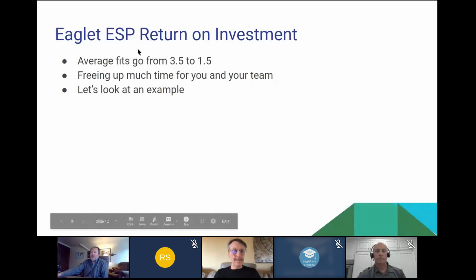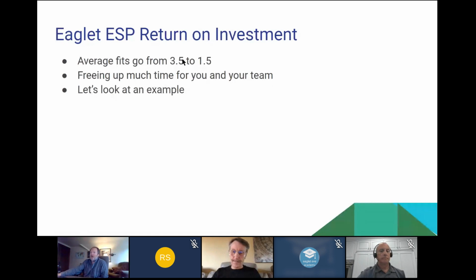So I'm going to talk quickly about the ROI. This will also be sent to you in the email. On average, my example relies on the notion that most of the experts and key opinion leaders with an ESP would agree that your average fit goes from 3.5 lenses per eye down to 1.5 lenses per eye. So what we're saying is we're not going to solve every single one, but you're going to spend less time trying to get to the endpoint with your patients, freeing up much time.